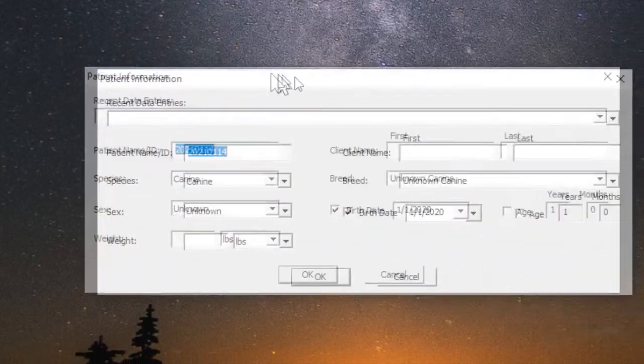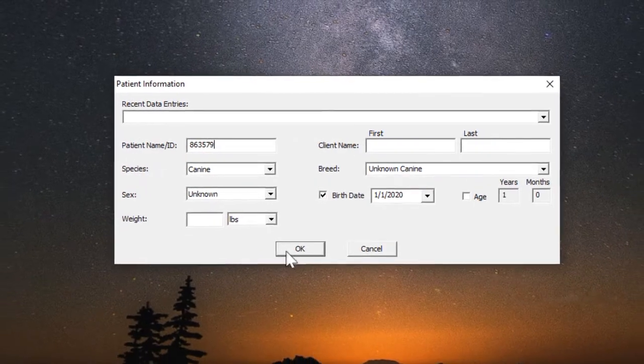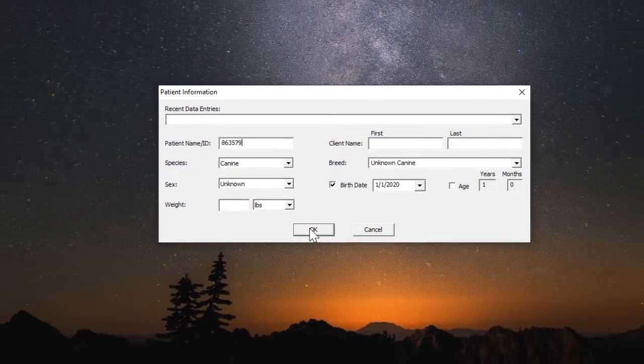Once you do this, you'll get a screen asking for patient information. This is part of our new policy rolling out — we need to enter the patient ID number so that we will have an interface to record our patient data in EasyVet for the medical record. In this case with Daisy, our number is 863579. The patient ID number is the only critical piece of information to enter; if you choose to enter the rest you can, but it's not necessary. Click OK.